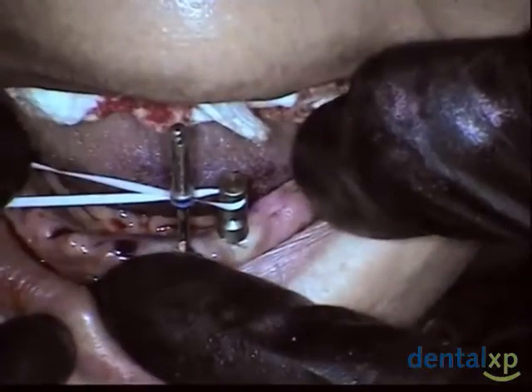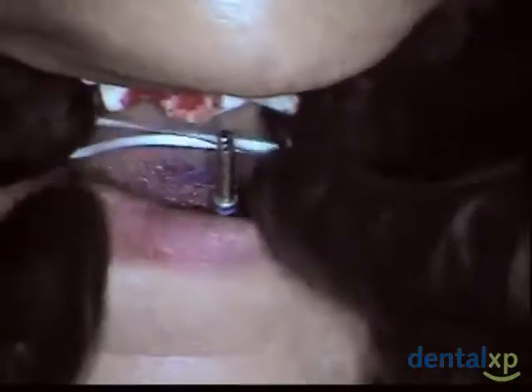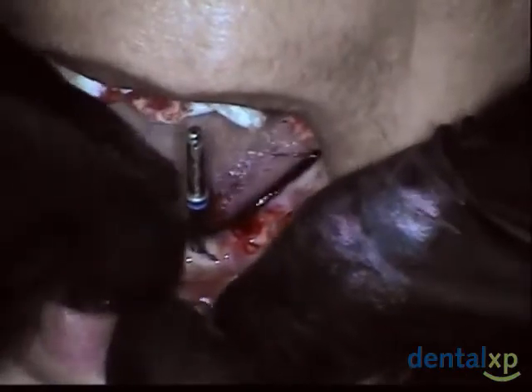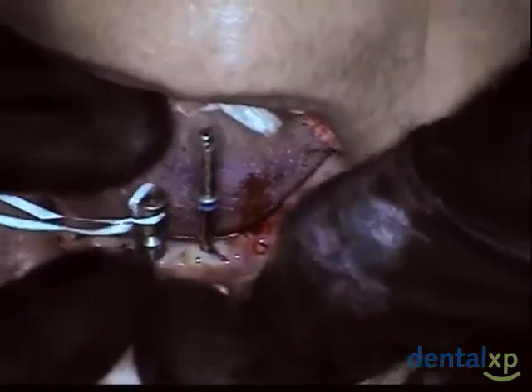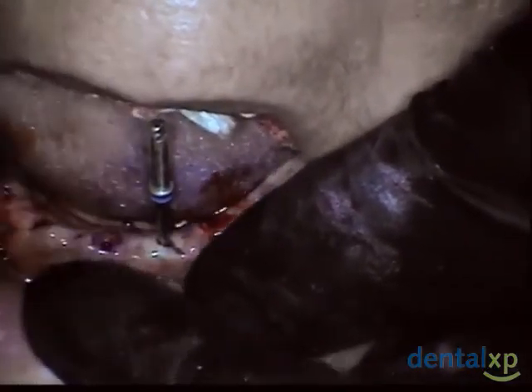that those two are parallel. So I can just move myself around on the other side of this. If A is parallel to B and B is parallel to C, then A and C are parallel. That's the only thing I remember from the math course I took. And we can see here these are in the same orientation, and we can just work our way on around.